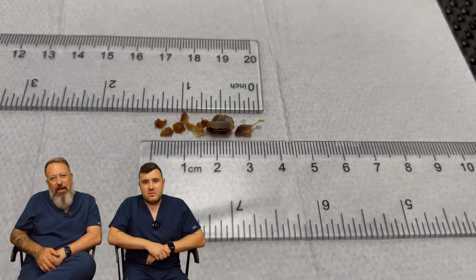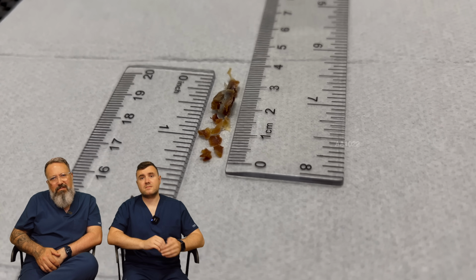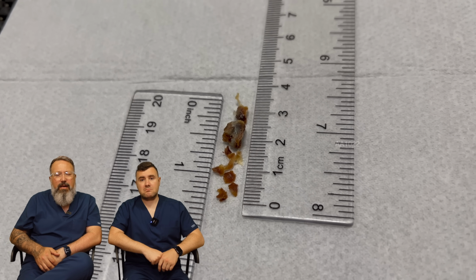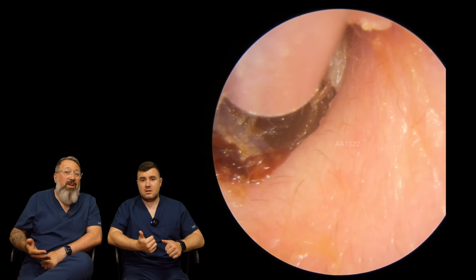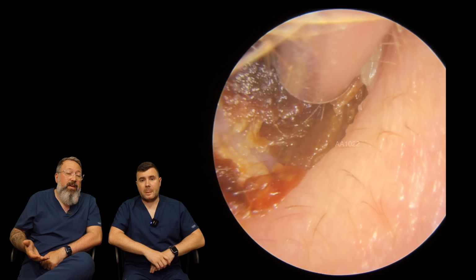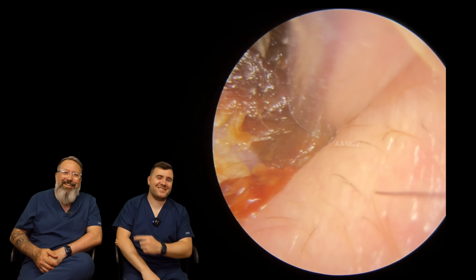There you go. I've got just over 3 centimeters, I'd say. Inch and a quarter again. Yeah, they've either been 3/4 of an inch or inch and a quarter. So this is mine. I've got skin and wax as well. This one's really dry, it's tough as old boots. This one, it's absolutely solid. There you go. We got it in there. See, look, we got it in there.